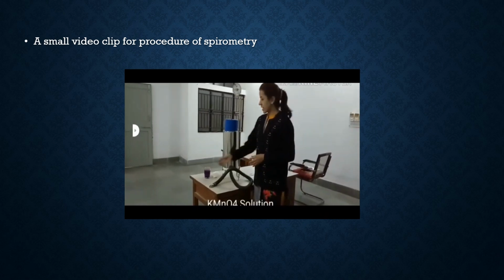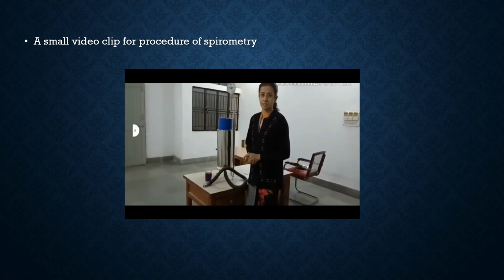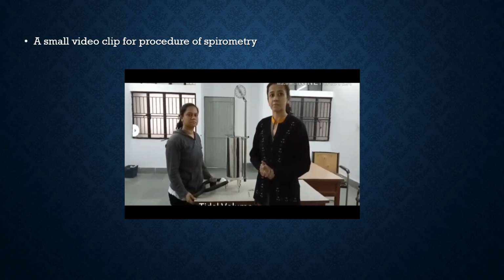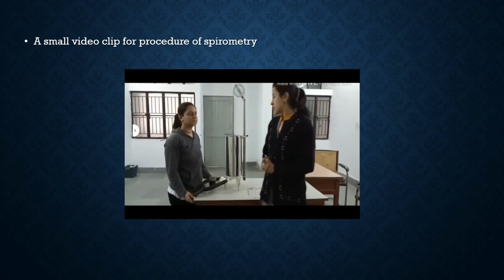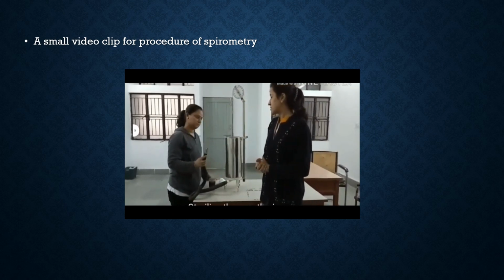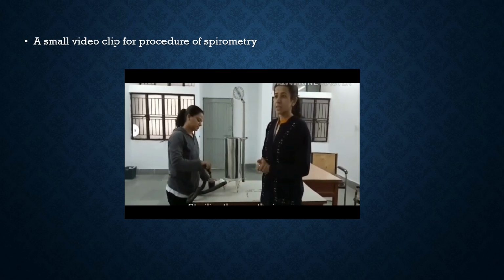We also require potassium permanganate solution as an antiseptic. Let us perform tidal volume. Tidal volume is the volume of air that is inspired or expired normally during quiet breathing. First, set the pointer at the 0 mark. Ask the subject to dip the mouthpiece in the potassium permanganate solution.